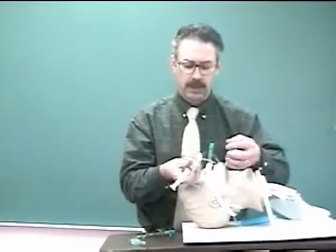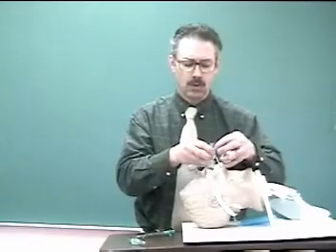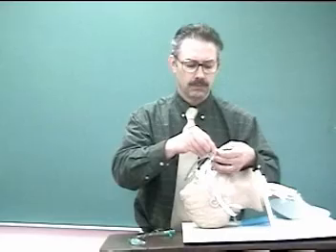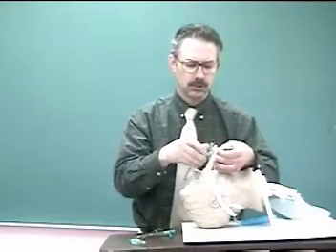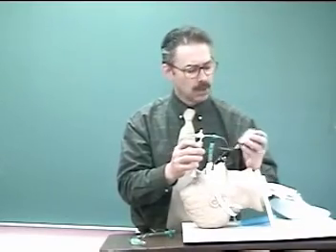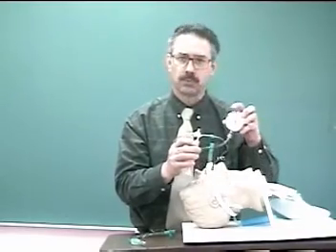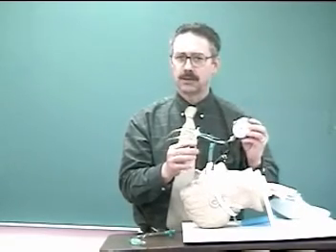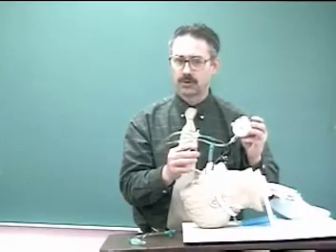Now we have it connected to the pilot balloon. We turn the stopcock to the fully on position so that all positions are on, as demonstrated in the lesson. From that we can check the pressure of the cuff and make sure that it's less than 25 to 30 centimeters water pressure.